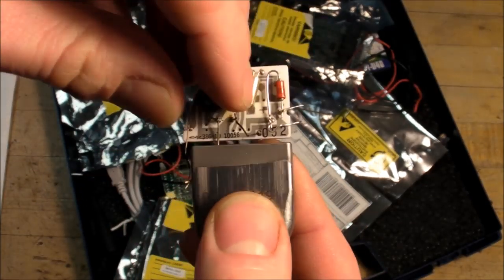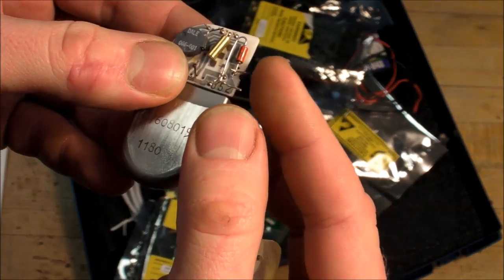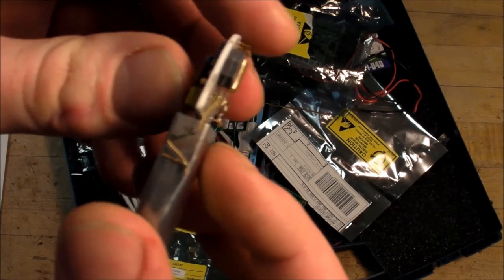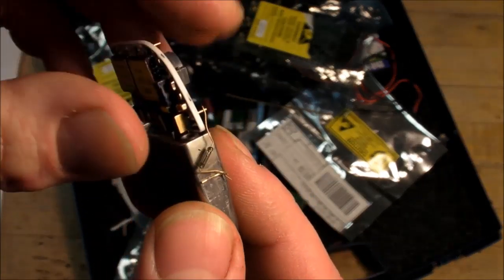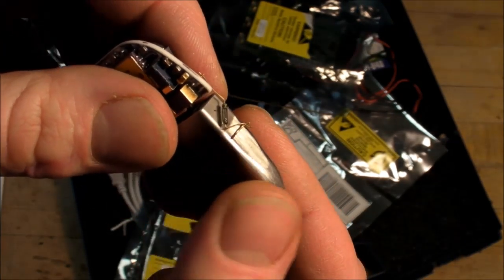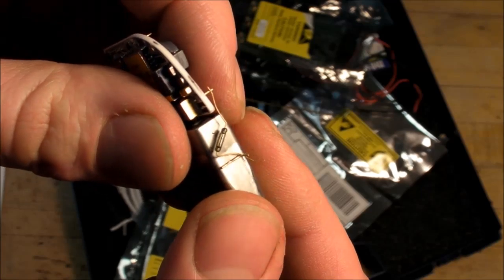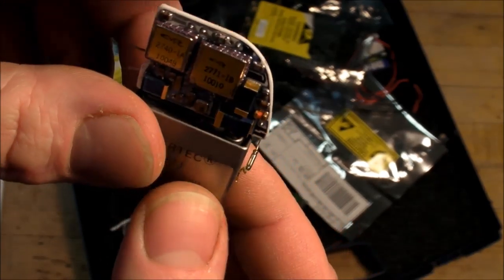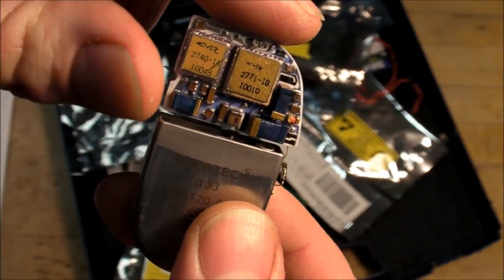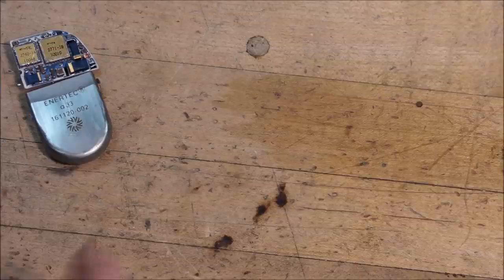And the students already cut some wires here. This one just went to the battery. This one is ground. This one is the output to the outside of the case. And what's really interesting here is that there is a very, very tiny reed switch. So apparently the doctor, or the patient, somebody would hold a magnet or an electromagnet up to the chest and close the circuit in that reed switch. Don't know what it would do. Maybe if you give it a magnetic pulse in a certain sequence, then it'll either increase or decrease the rate at which it sends a pulse to the heart.